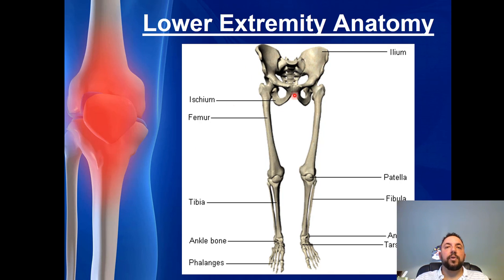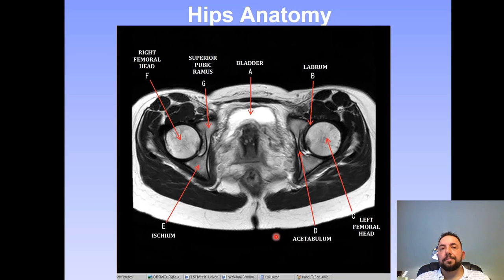In the lower extremity anatomy, if we're doing something like the hip, we want to stay in this region here. Hip, actual dedicated hip itself versus femur, where we need long bone coverage, versus tib fib, but the knee we would want a coil specific to that, or the ankle as well.